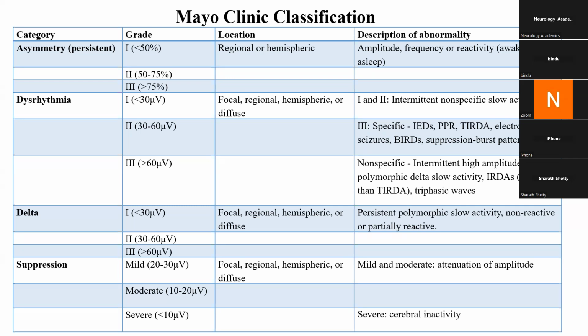When you ask in the EEG machine system or the electrophysiological system, the most crucial thing is your differential amplifier. It is not just an amplifier; it amplifies the activity. The microvolt activity that you get from the brain comes to the electrode, and the conduction is increased with the help of the conductive paste that you use. But more than that, it amplifies. But it's a differential amplifier, not the usual amplifiers which are used in physics. It's a differential amplifier for the same reason. If one electrode has the same activity plus 10 microvolt and the second one also has plus 10 microvolt, the differential amplifier becomes blind and it rejects it.